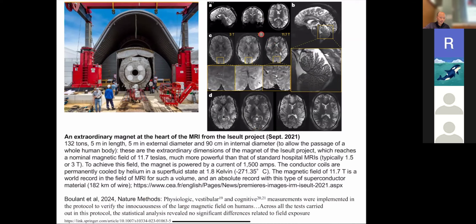Okay. Now, there is one thing if you are close to one of these magnets: if you ever go near, not so much a 3 Tesla, but anywhere like 4 Tesla, 7 Tesla, 11.7 Tesla, if you shake your head, especially near the opening of the magnet, you can get very nauseous or dizzy or even see flashes of light. So going back to freshman physics, if you're in a magnetic field and you move in a magnetic field, what's created?